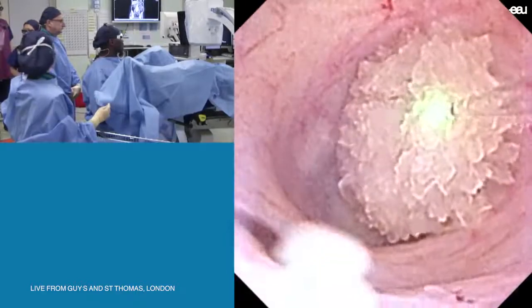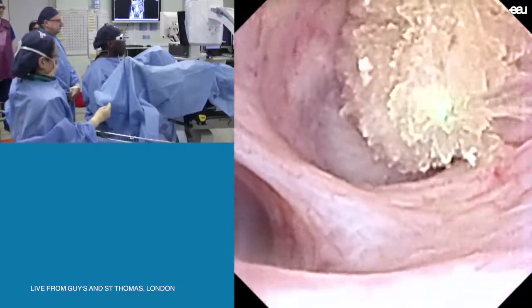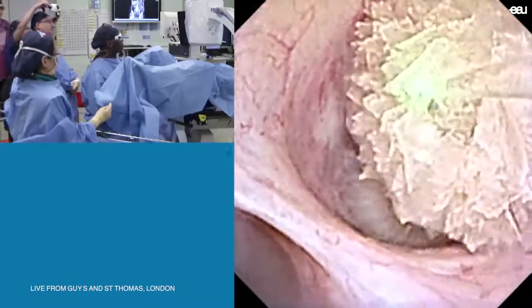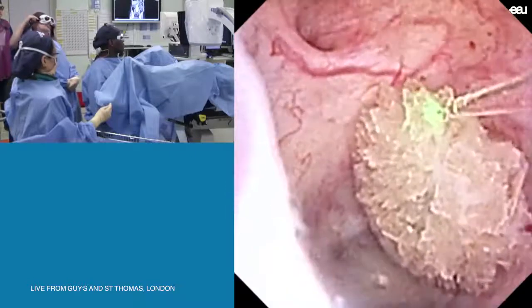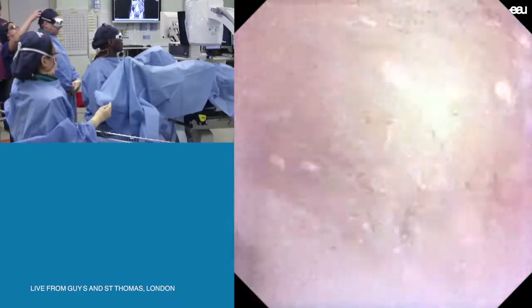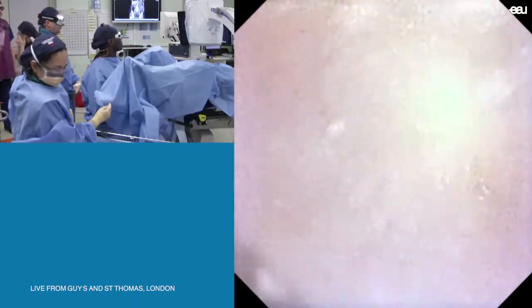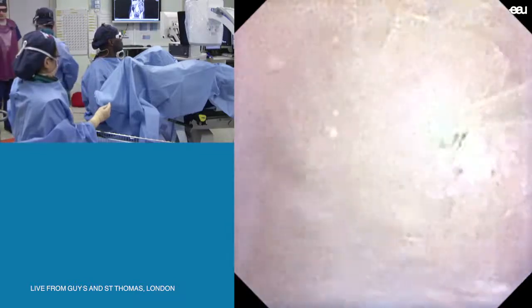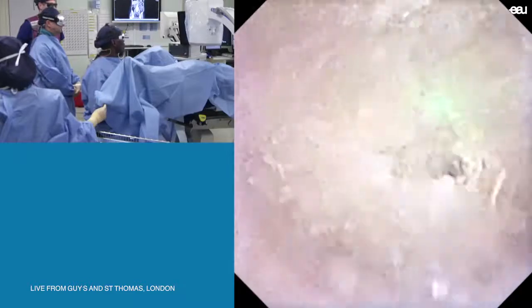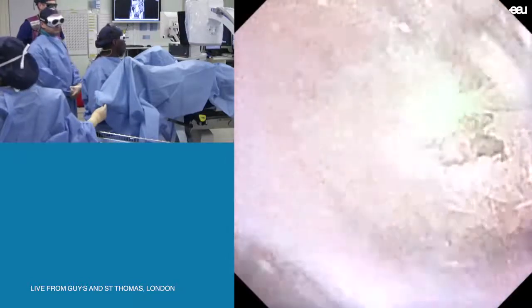Laser ready when you are. Our settings: 0.8 and 5 to start with. We'll go short pulse, please. So this is quite a soft stone. What are your settings right now? 0.8 and 5 on a short pulse.